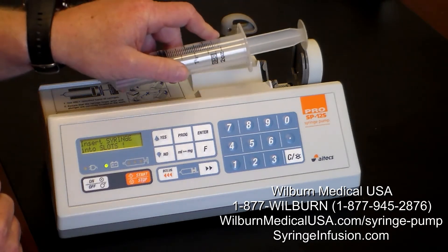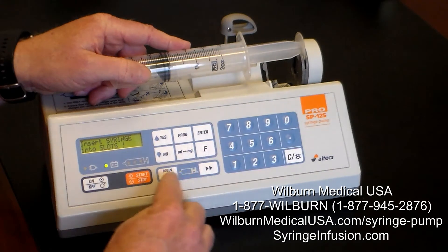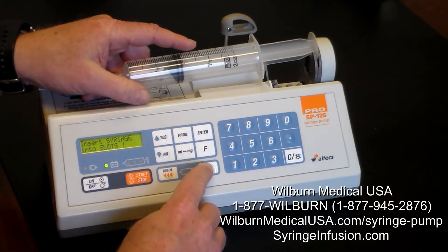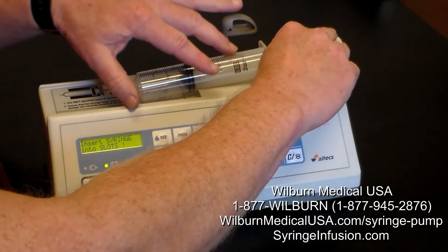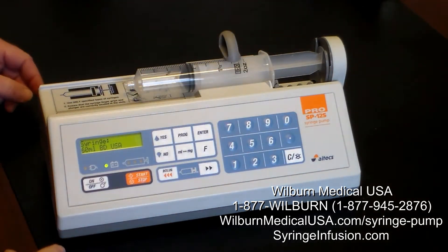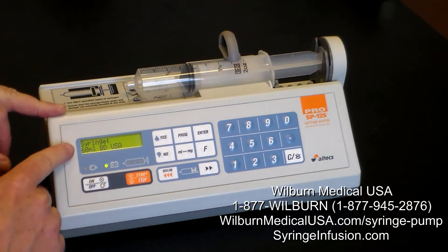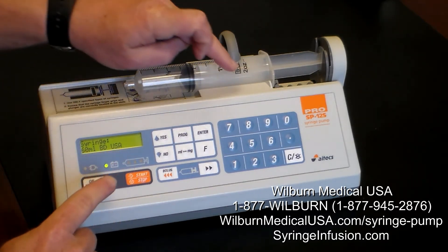We simply take the syringe plunger and put it into the pusher block using the left-hand and right-hand arrows. We advance the syringe until it aligns with the groove, then bring over the plunger. It now confirms that we have a 60 ml BD USA syringe, and that's what we're using.